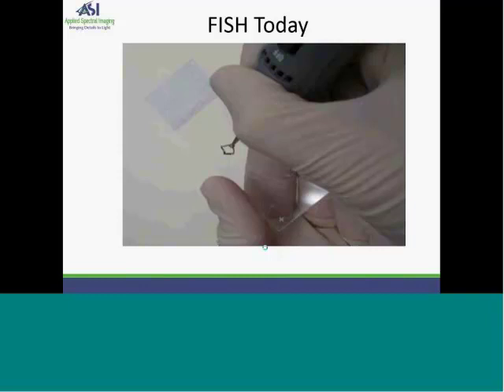And even after the pathologist sends the slide off with the diamond engraved area, the pathologist has to trust the results from the lab that they really scanned the region of interest which was marked off. As this method is not done digitally, there is no documentation of the work performed to show the pathologist from which area of the slide the results were taken. And should the encircled area not be correct, there is no clear way for the FISH technician to know that the work being performed is essentially of no clinical value.